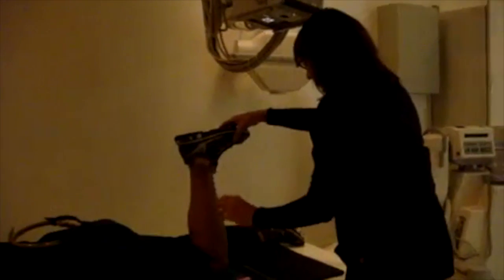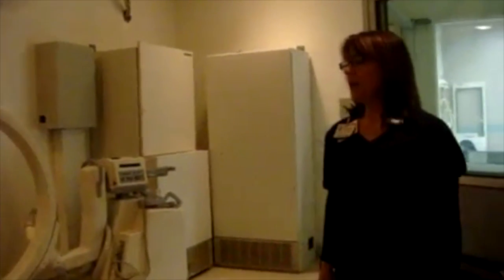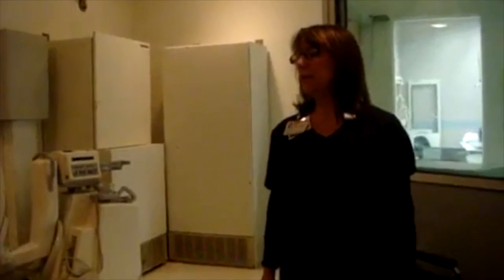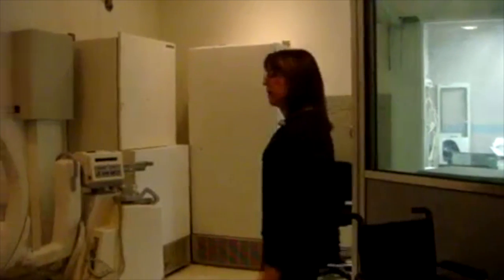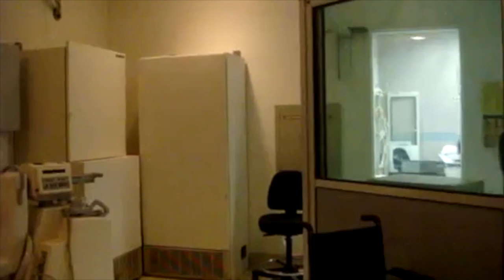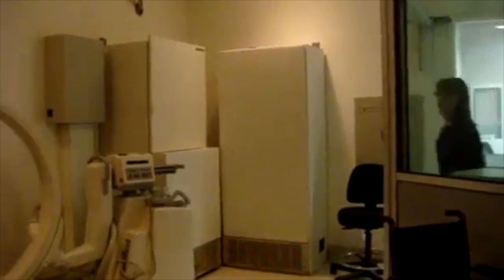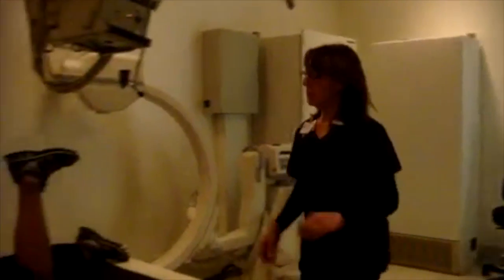So hold real still for me. Real super still. Good. Okay. So my technique for my Settegast method is going to be 75 at a 4 mAs. I'm going to drop my mAs down to a 4. Okay, hold real still for me. X-ray. Okay. You can relax.